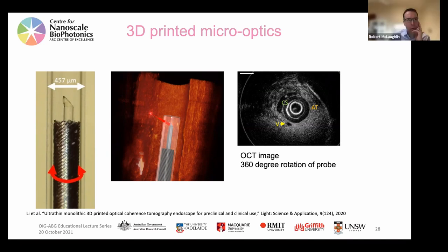With the Nanoscribe that we use, it's all proprietary compounds, so I don't know the chemicals of that. You can certainly track down what information you can. I think generally it's a photoresist that's cross-linked in the UV range, and their two-photon process can come up to the right power of light. But they tend to be relatively protective around the details because there's a lot of IP in how you make those chemicals.